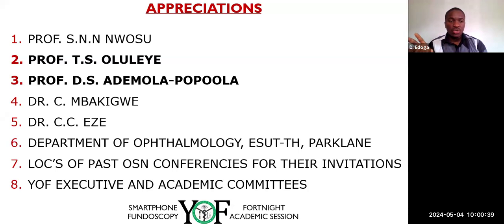So plus 20 gives you a magnified image, so you lose out field of view in your plus 20. It may be difficult for you to see the optic disc and the macula in one setting. Unlike if you are using lenses that have wider field of view, you can see the optic disc, you can see the macula, then you can see temporal to the macula, you can also see nasal to the macula in one shot as the posterior pole.